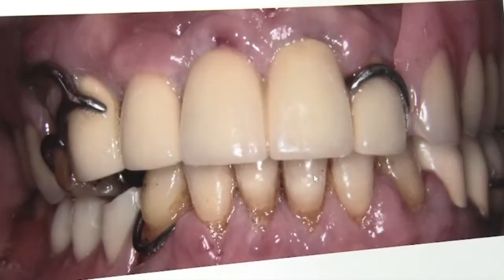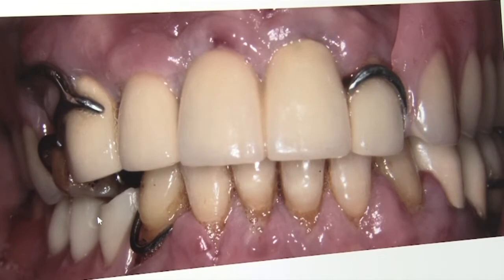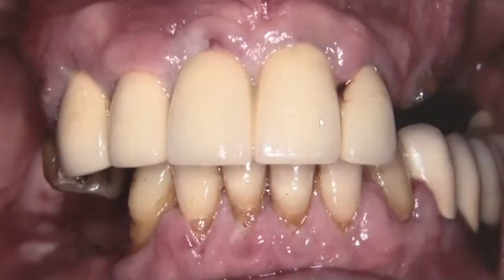When I first met Valentina, she was wearing an upper removable partial denture and a lower removable partial denture. Taking the upper removable and lower partial denture out, you can see that she has these upper anterior teeth with rampant decay, this lower left bridge with rampant decay, and nothing in the right posterior.